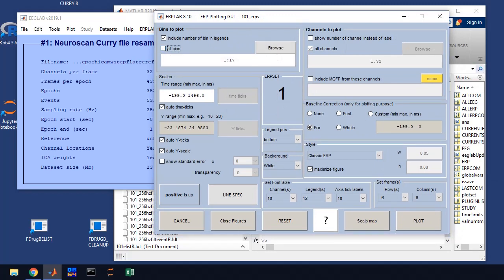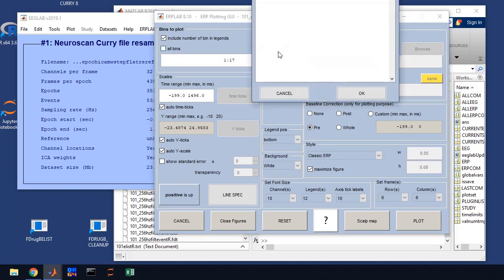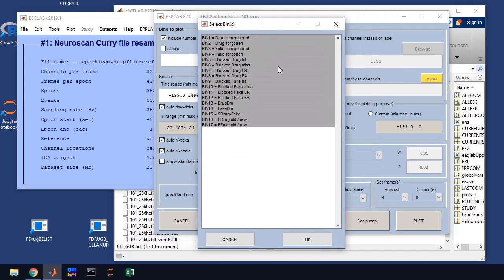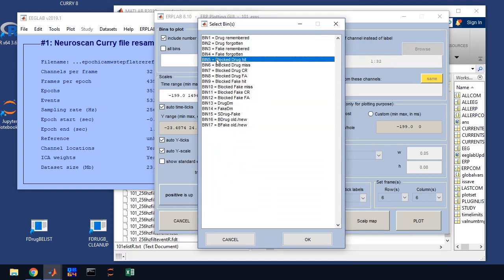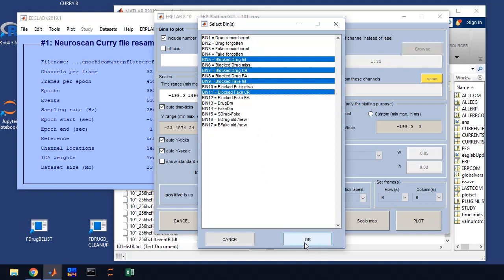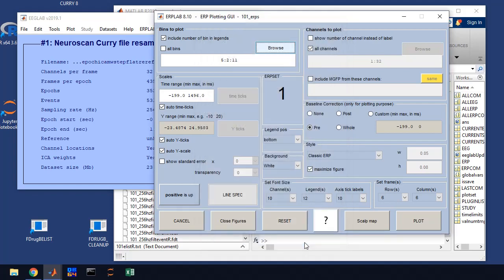You'll get this window that will come up. First thing is, we're going to select, we're not going to plot all of the bins, you won't be able to see anything. So we're going to select the bins and this is specified in the protocol. So I'm just going to have you do five and seven, and then nine and 11. So basically it's hits versus correct rejections for drugs, hits versus correct rejections for fake drugs in this study.